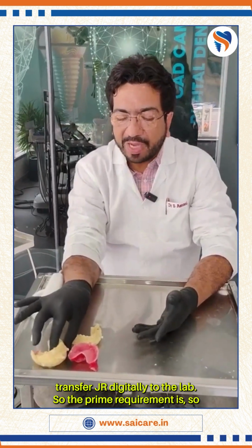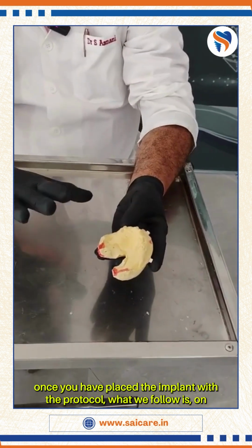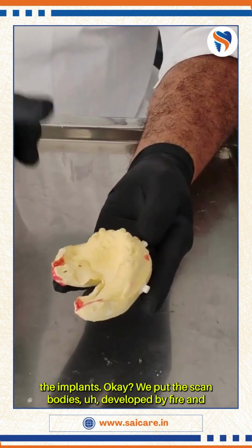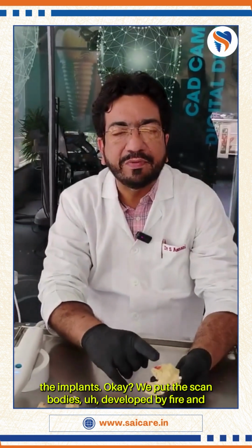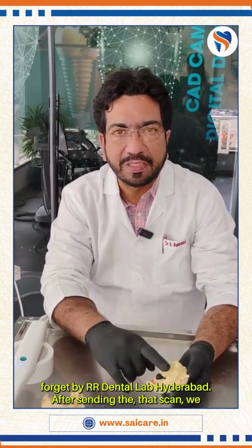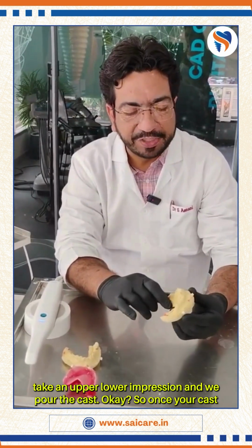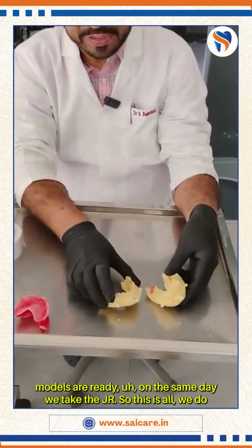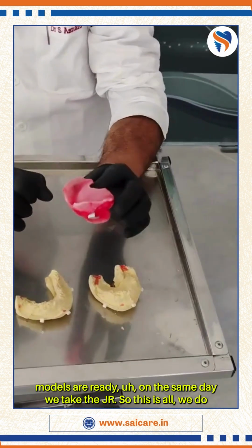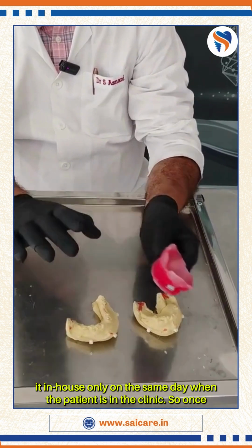So the prime requirement is, once you have placed the implant, the protocol we follow is: on day 1 we place the implants. We put the scan bodies developed by Fire and Forget by RR Dental Lab Hyderabad. After sending that scan, we take an upper and lower impression and we pour the cast. Once your cast models are ready, on the same day we take the JR. We do all of this in-house on the same day when the patient is in the clinic.